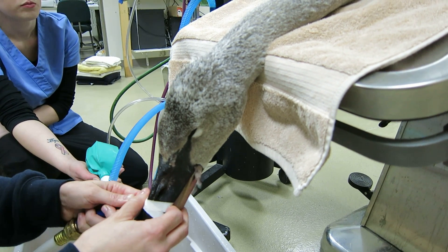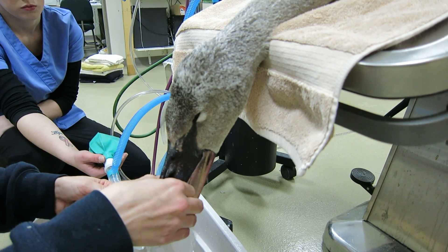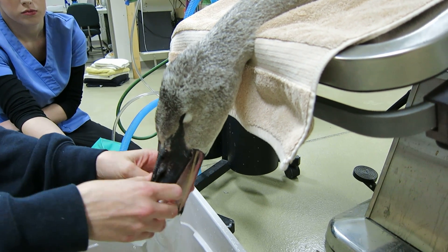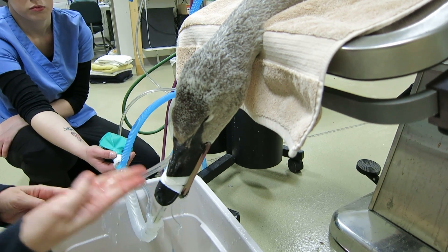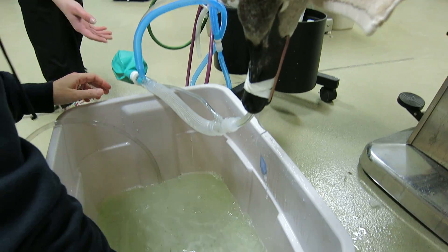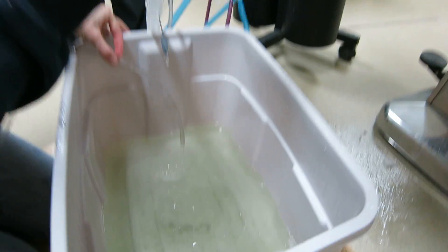We've got quite a bit of debris here at the bottom of the bucket, so we're going to go ahead and pull the tube out. We're going to take another radiograph and see where we're at and if there's still lead present. You can see down at the bottom of the bucket there are some darker pieces — those might be the lead pieces we're worried about. We'll take the radiograph and see if those are our lead pieces and if we need to do further washing.